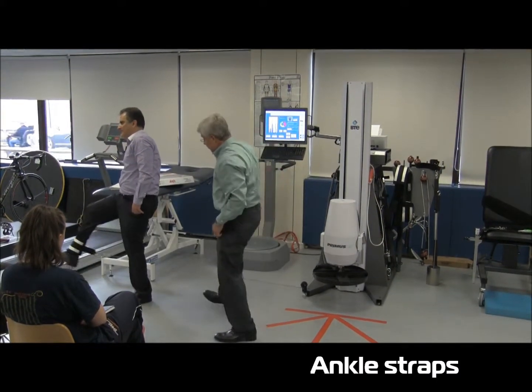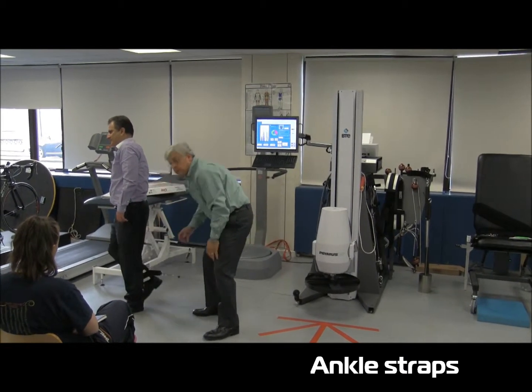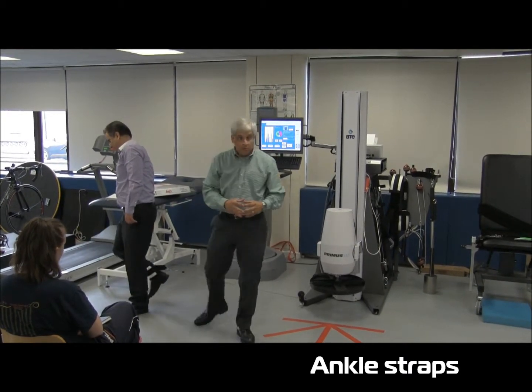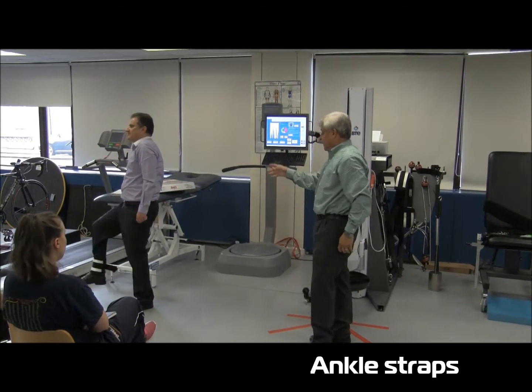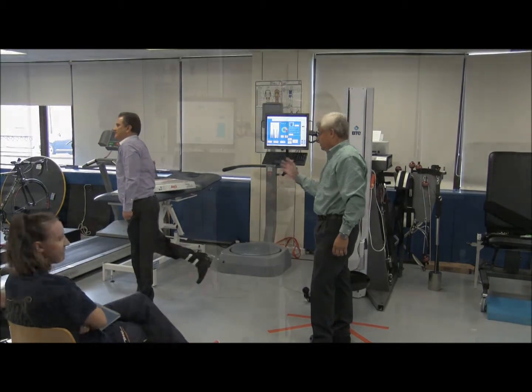You will feel an incredible load on the hamstring right here. And that's really what happens when you're running. If you take the hand from the chair off, you'll feel even more.